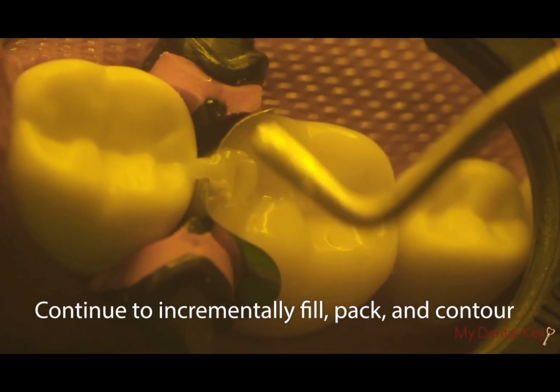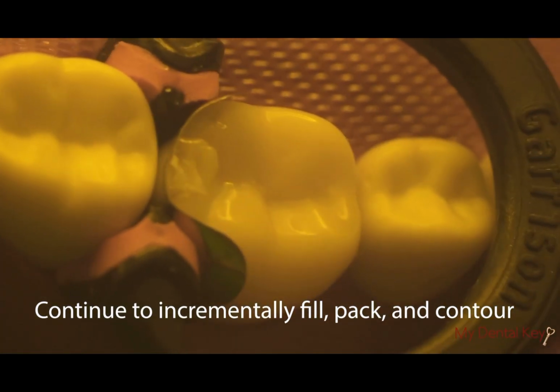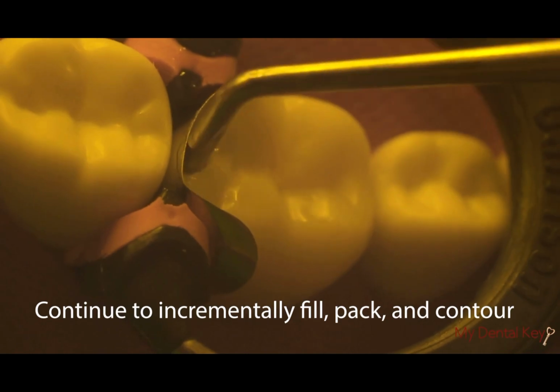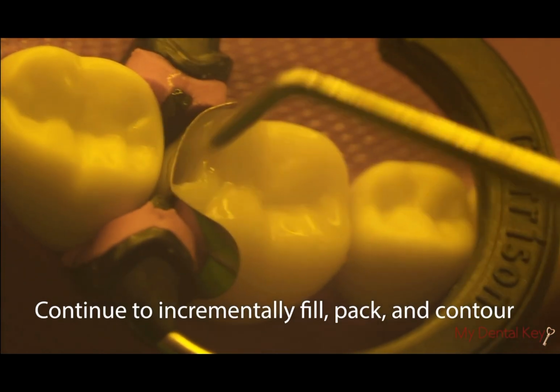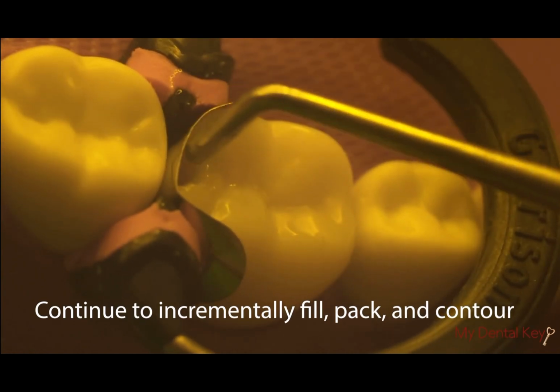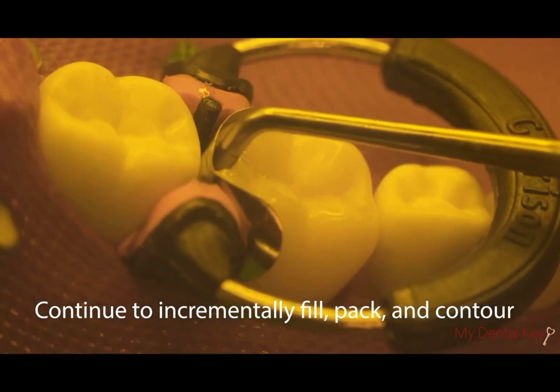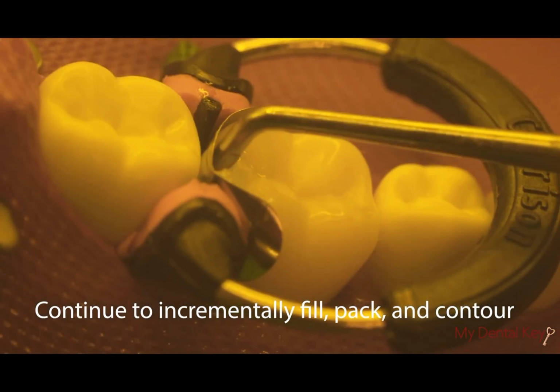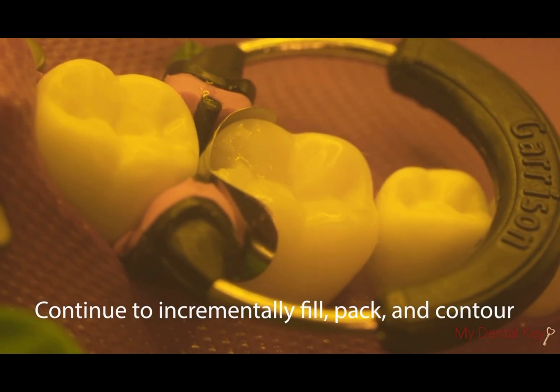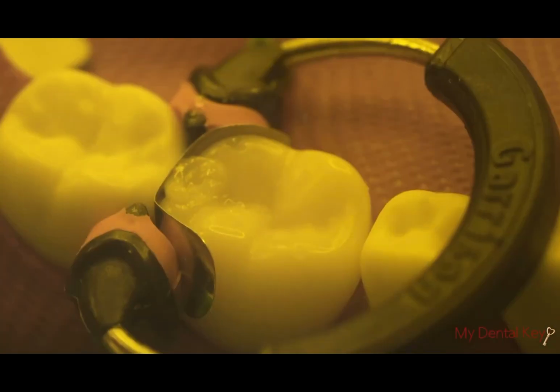Incrementally fill, pack, and contour until the proximal portion of the preparation is nearly filled. The more carefully and thoroughly you pack your composite, the less chance you have of having voids in future steps. Ensure that the gingival area of your proximal box is adequately filled. You will not have reconstructed the marginal ridge at this point in the procedure. Light cure between increments of composite.